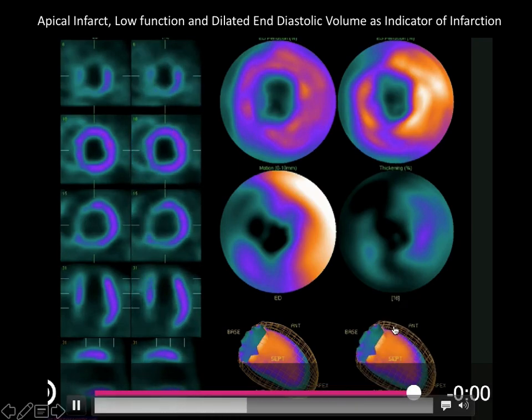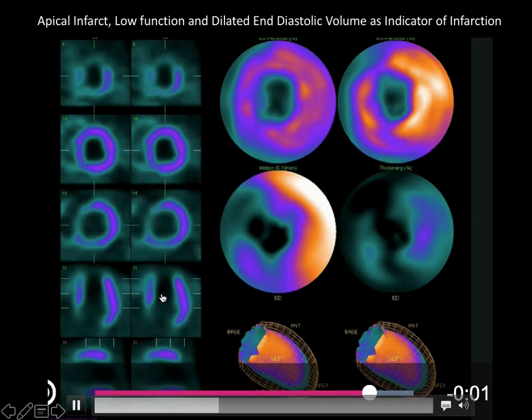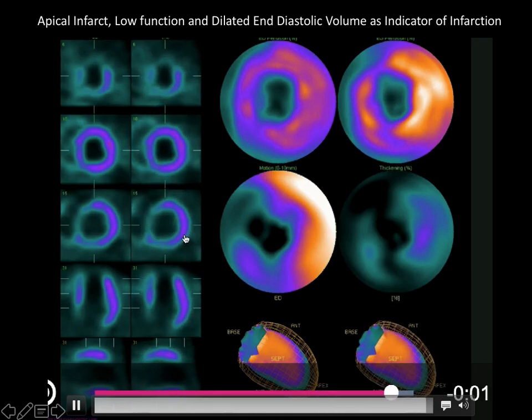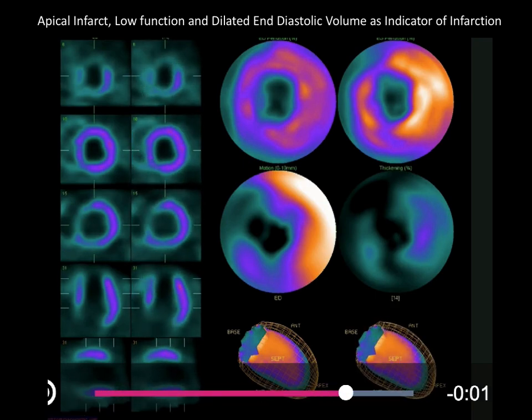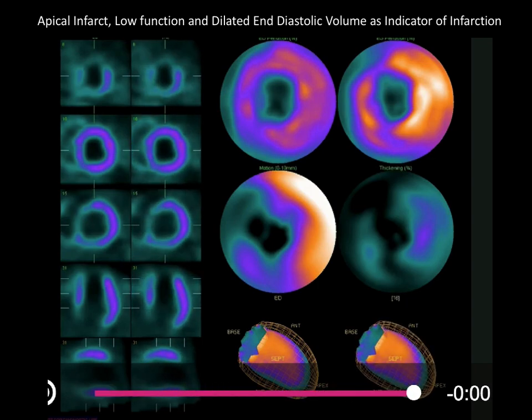And their function also, when you look at this model of how the heart is contracting, derived from these dynamic scans, even though we only have data in the areas that have tissue with the signal in them, right? We don't have any data at the apex because it's gone. When you look at how this is contracting, you can determine that it's not contracting terribly well. So the ejection fraction, the fraction of blood that's being pushed out on each beat, is quite small. And so the heart is under some duress.